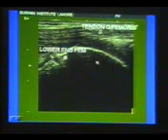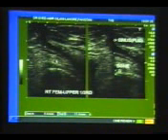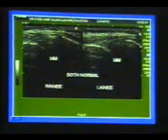You can even find some small fractures, tendon of the quadriceps femoris, and this is the lower end of femur, and there was a small fracture. There is bone, and you can see a sinus with pus and a part of quadriceps femoris before its insertion. These are medial menisci on both sides, both are normal.